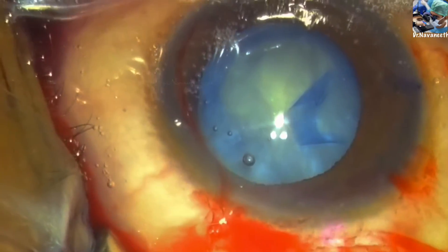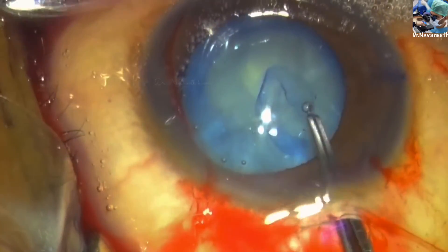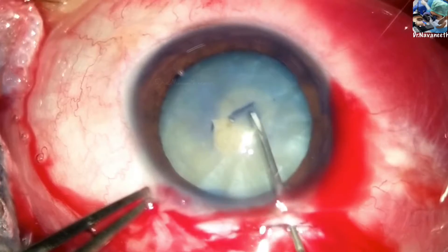Intralenticular pressure is counteracted by repeatedly inflating the anterior chamber with a viscocannula. The second method is spiral rhexis, also called onion peel capsulotomy.